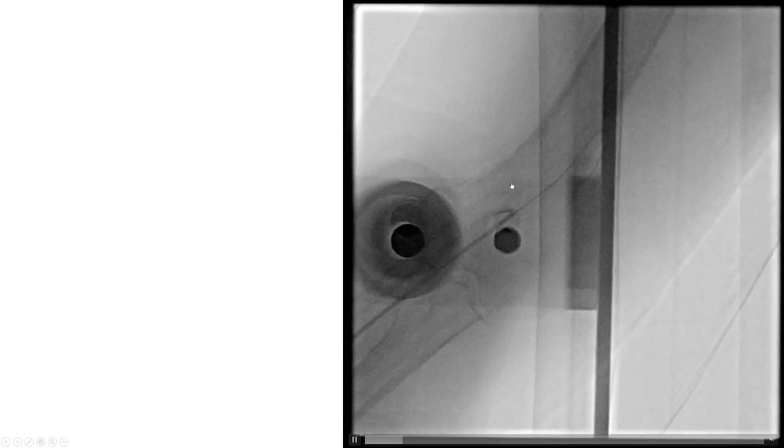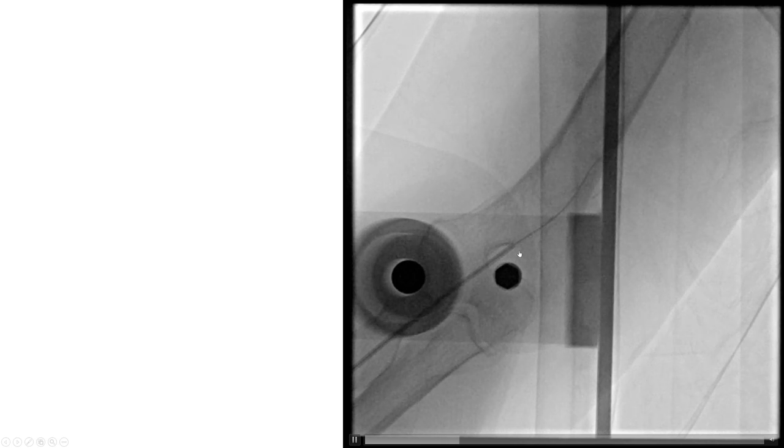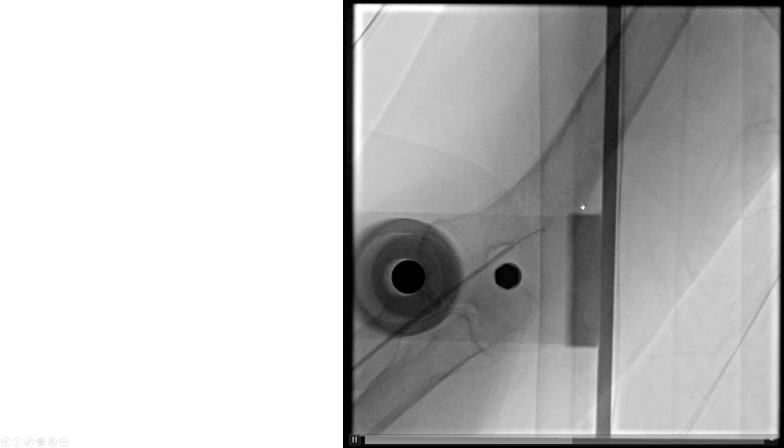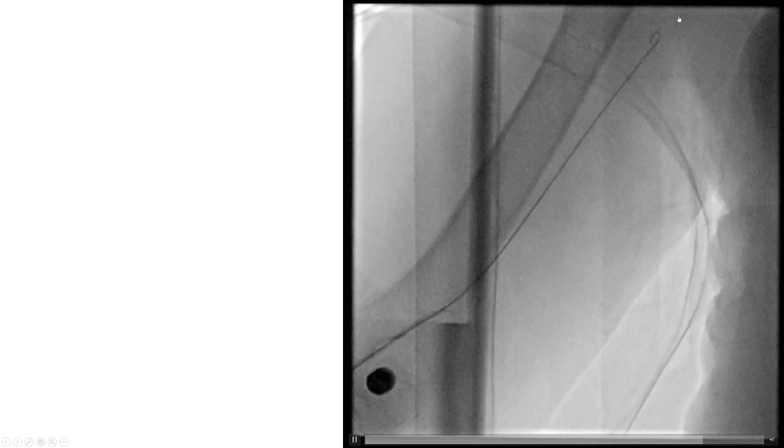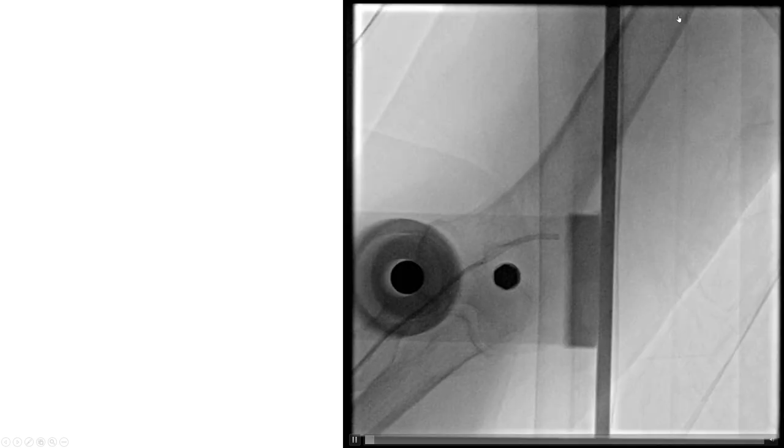Eventually, the 0.014 wire straightened out the loop and facilitated subsequent catheter advancement. The catheter was advanced further past the area of loop; however, there was still difficulty getting the wire up, as the 0.014 wire kept entering a side branch. The solution was to advance a J-tipped wire — the J-tip prevented the wire from getting into the side branch, and then the catheter could be advanced further up into the brachial artery.